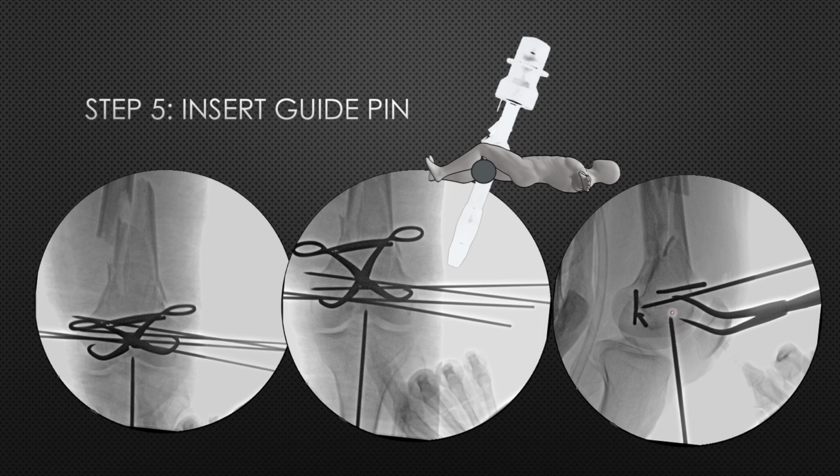You see here it is going to direct towards the intramedullary canal, and it is in the terminal part of the Blumensaat line. Now sometimes this AP view is not clear because the hip is flexed to 30 to 40 degree. So for better assessment of the AP view, you can simply tilt the C-arm in direction of hip flexion. So that will tell you the exact true AP view of distal femur.